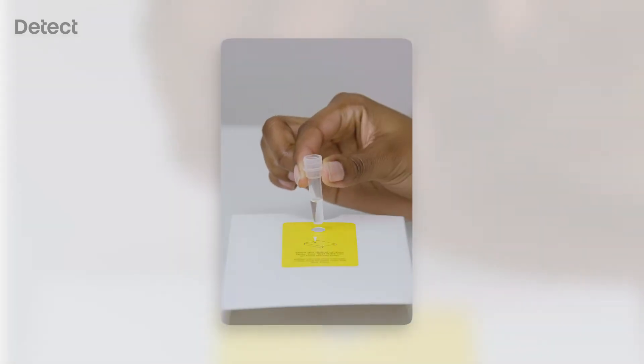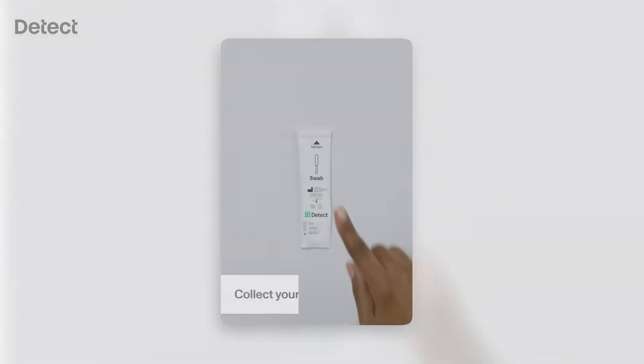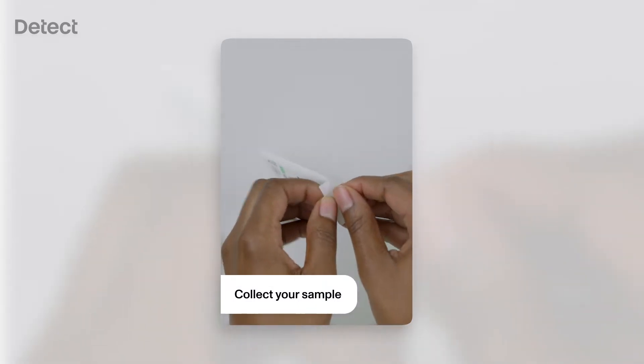Carefully open the test tube and place it in the cardboard divider. Open the swab without touching the soft tip.